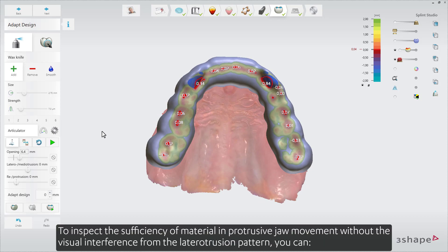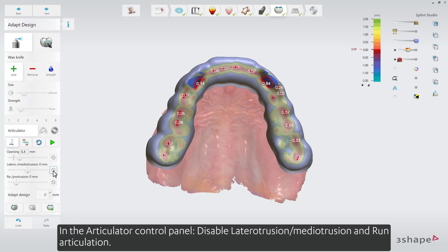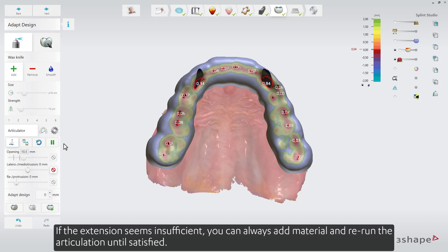To inspect the sufficiency of material in protrusive jaw movement without the visual interference from the laterotrusion pattern, you can, in the Articulator control panel, disable laterotrusion/mediotrusion and run articulation. If the extension seems insufficient, you can always add material and rerun the articulation until satisfied.